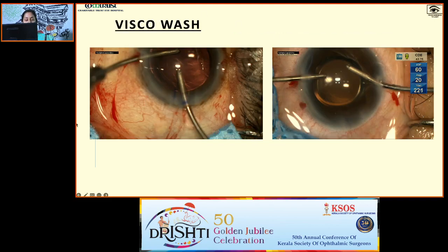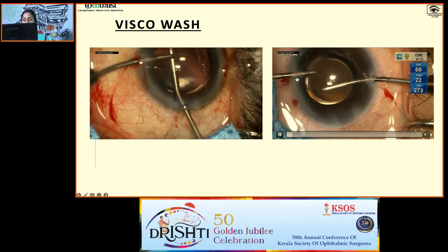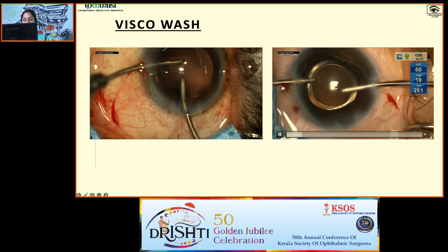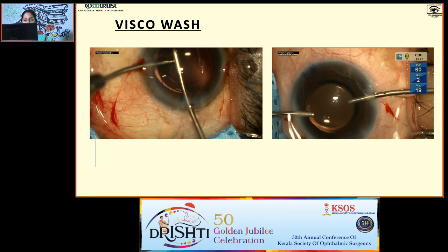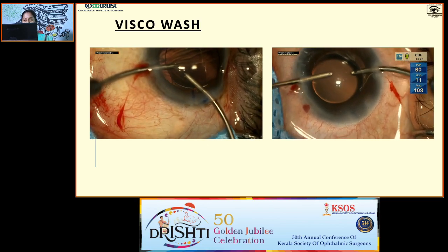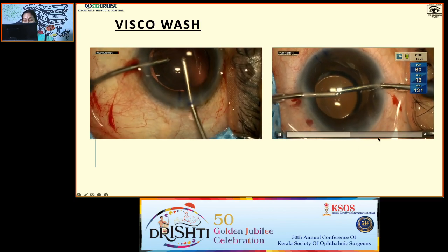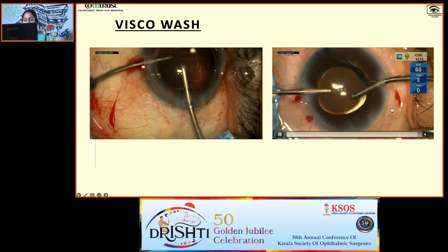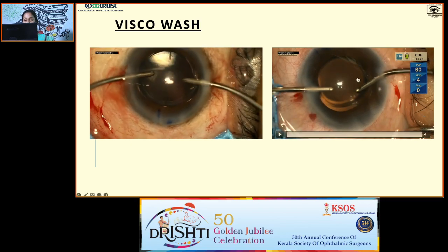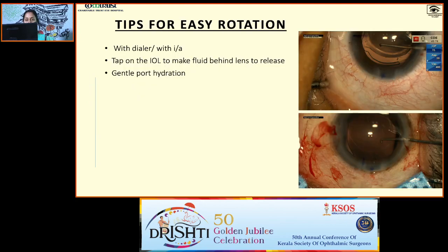Once you complete the IOL implantation and rotation to the desired axis, next thing is the visco wash. Do it completely, and with your aspiration cannula, you can just slide the IOL to one side, and through the gap you can keep your aspiration cannula just under the IOL. Swipe under the IOL and do a complete cortical wash, complete visco wash. Once it is completely free of visco, you can just tap the center of the IOL so that it will be a little bit adherent to the PC, that is bioadherence will be enhanced.